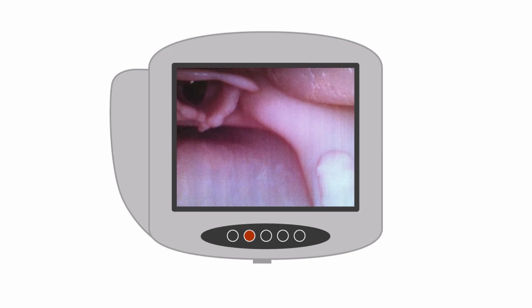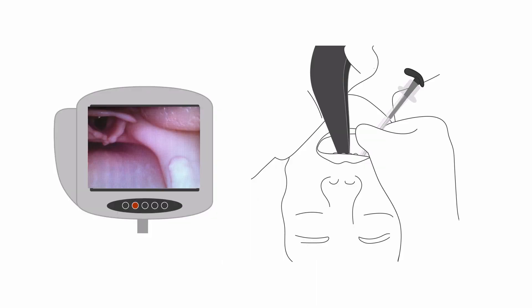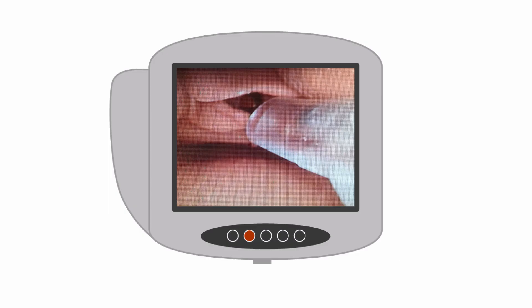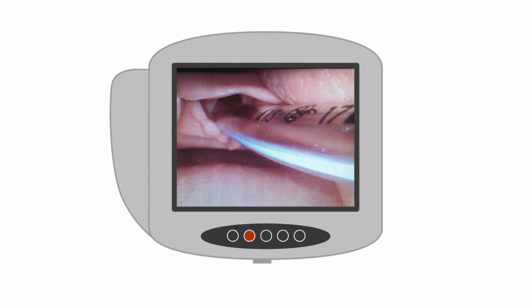Now you can follow the camera view as you glide down the tongue into the vallecula and see the epiglottis and the arytenoids. Once you see the arytenoids or even the cords on the screen, follow the angle of the blade with your loaded stylet and watch as you push the tube through the cords.